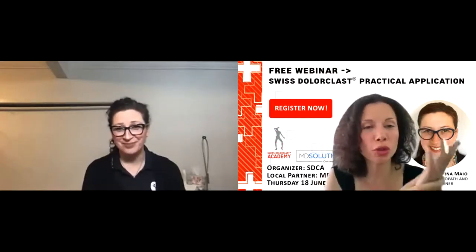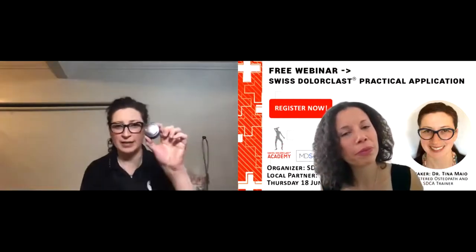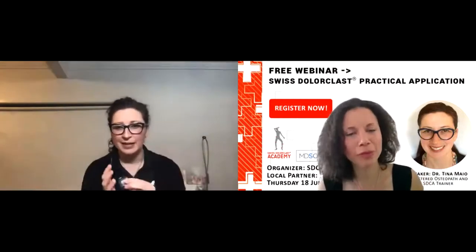Okay, so you do 2,000, 2,500 shots on the head. So quite often I deliver 500 with this head, the bigger head. 500, get the blood flow into the hand, start to open up the fingers, and then really target those really annoying bits that are really responsible for that contracture. Okay, thank you. Yeah, so generally it'll be 2,000 to the hand.